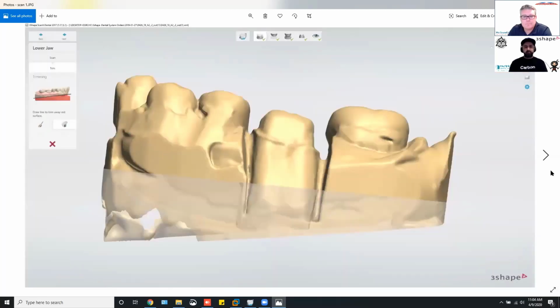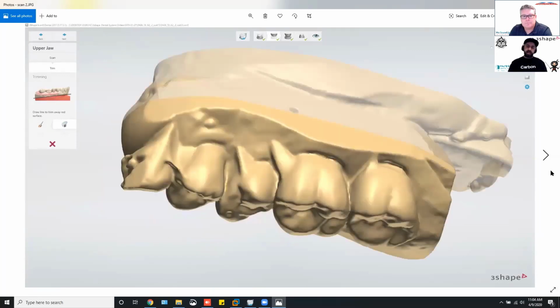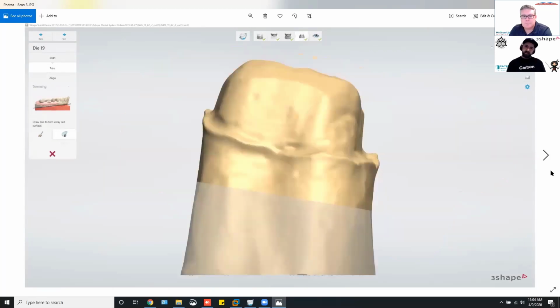And then for crown and bridge, my big tip is just keep the scanner going. In order to do that, before I start scanning, I have everything laid out. I have my model on one plate, my opposing on the other. I scan the model with the die in, then get the opposing scanning. While that's going and this is finished, I have the die on another plate that's ready to go. So I'll scan the die.